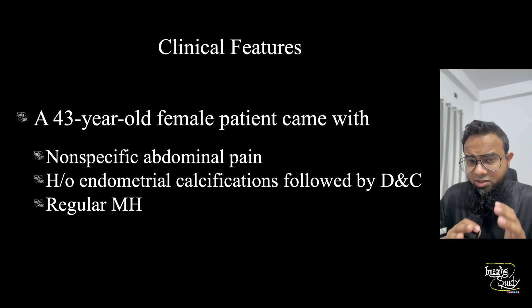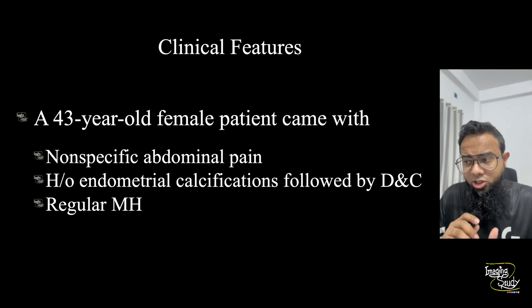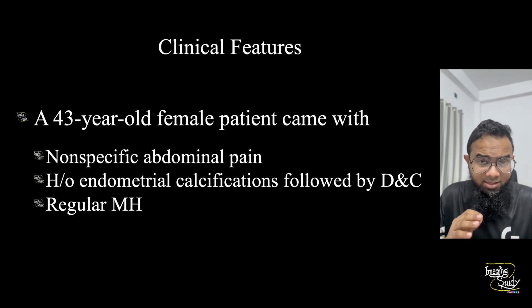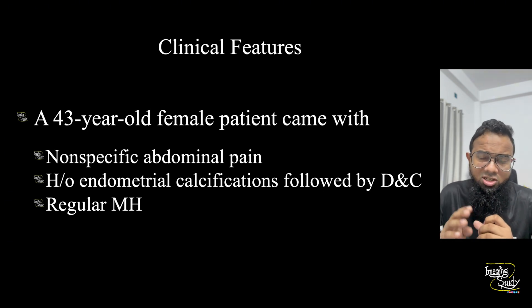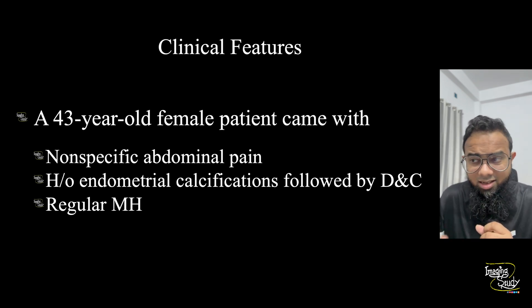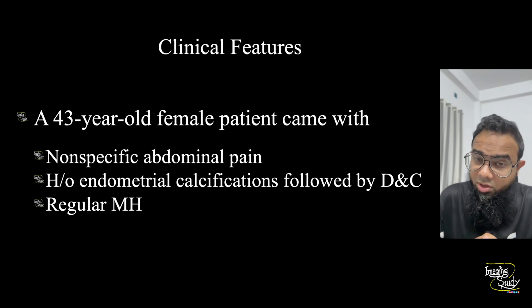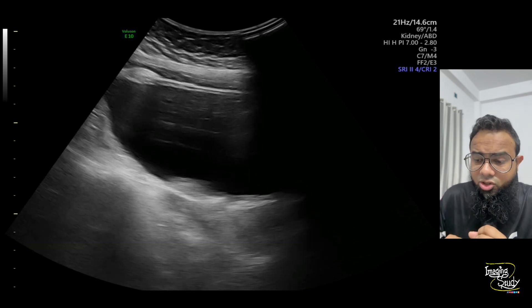She has a history of endometrial calcifications diagnosed on previous ultrasound scans, and then she went for a D&C — that is, dilatation and curettage. She reported a normal menstrual cycle with no severe dysmenorrhea or menorrhagia. Let's see what we have on ultrasound.